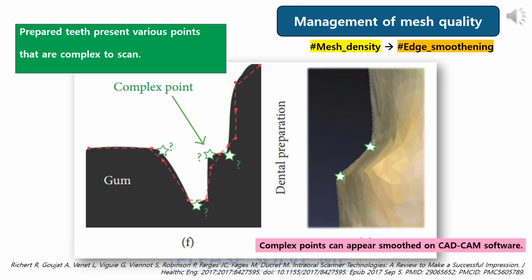The scanner is able to display the high-quality detail that we want it to, but because it's not necessary, it does not. Simply put, this is because what we are making is a prosthesis, not a nano-sized semiconductor chip.